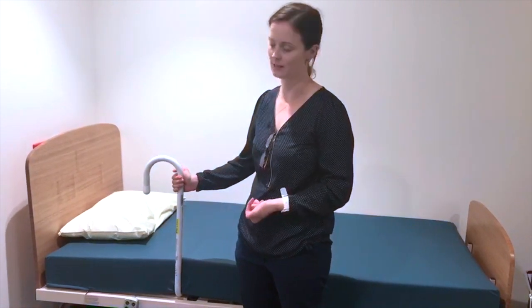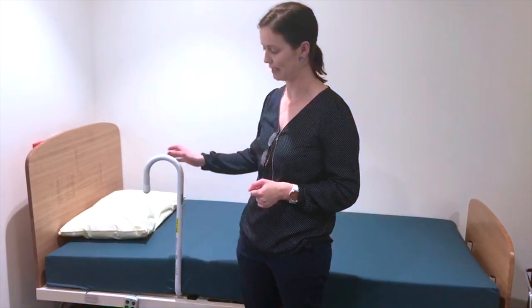You might need your helper to help you with this each time you use the bedstick. Please also make sure the bedstick doesn't move — your helper can assist you with this also.